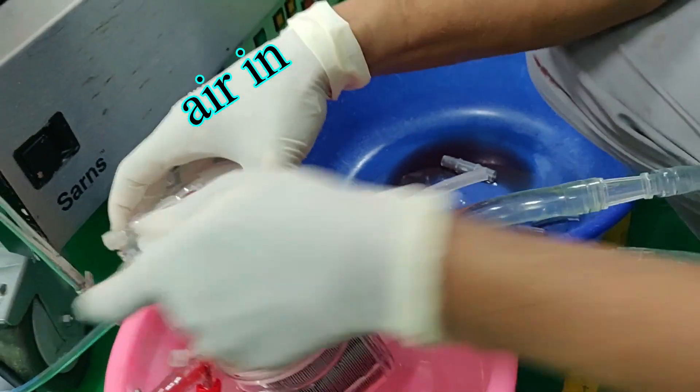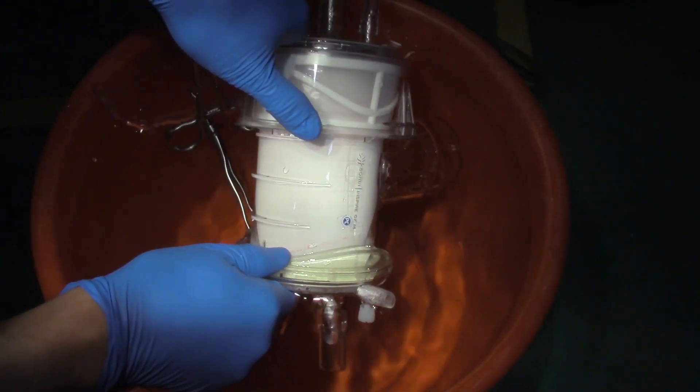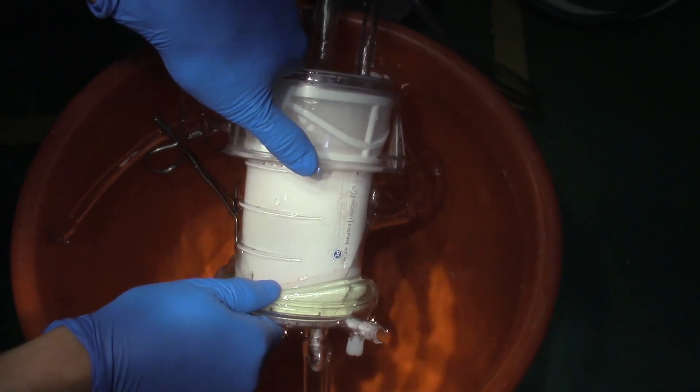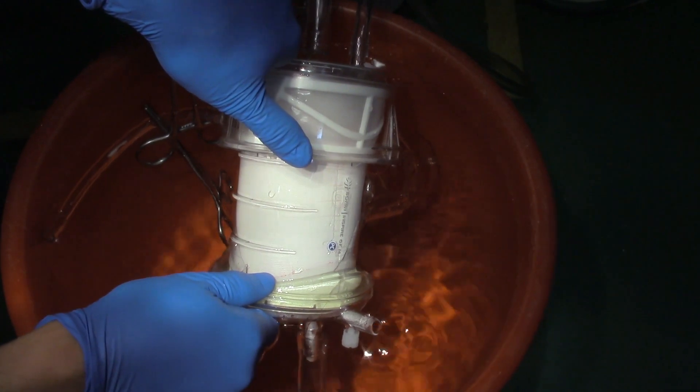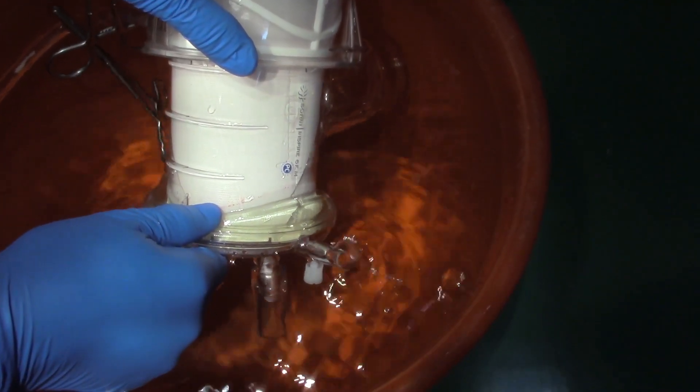So we tried to apply the same mechanism or technique to another oxygenator of another make and found that there was air escaping from the oxygenator when the air outlet or air exit was blocked by a clamp.